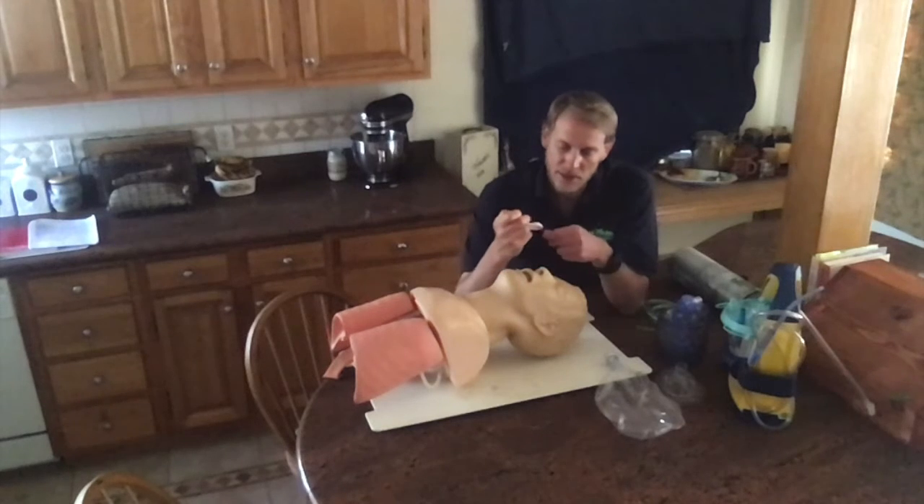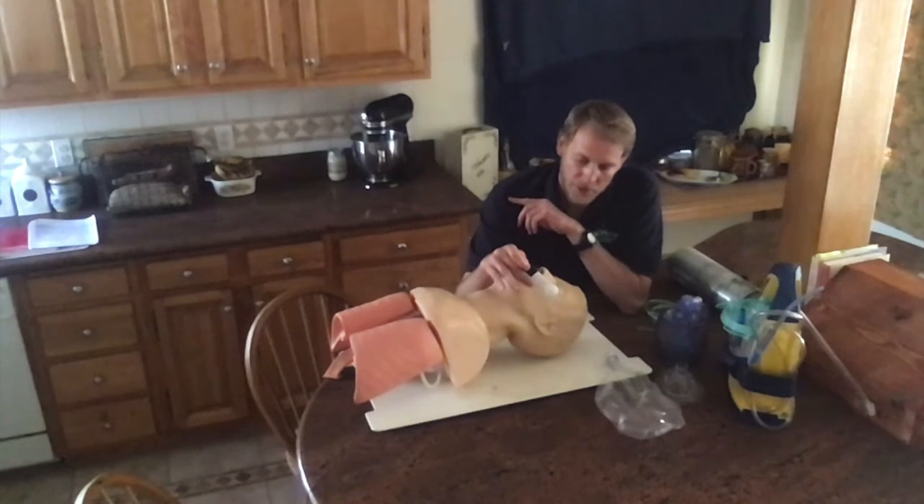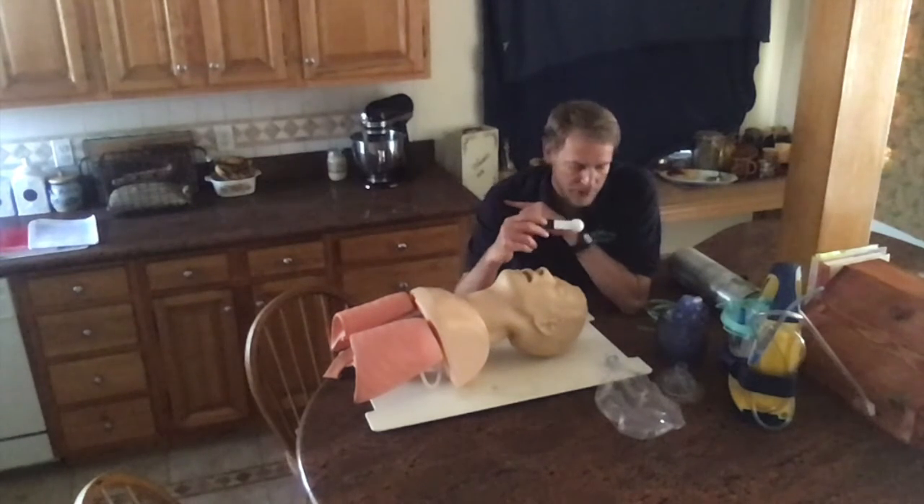Before beginning, I would measure the OPA from the corner of the patient's mouth to the jaw. It's about the right size and should be appropriate for this exercise.